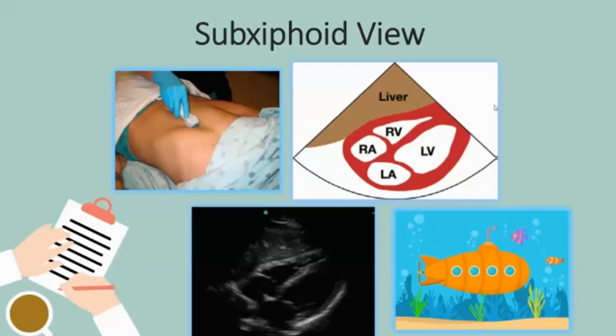And yeah, what Tammy always says with this is that you've got to be like a little submarine and you've got to try to sink below the sternum to get a nice view of your cardiac windows.